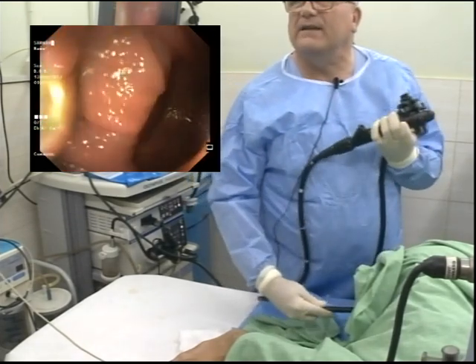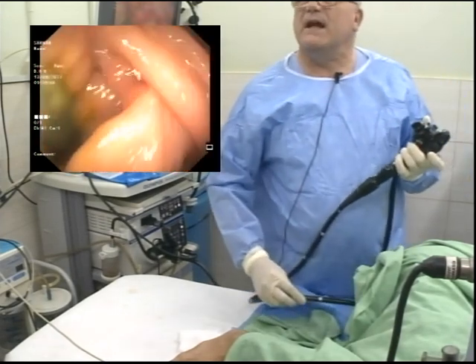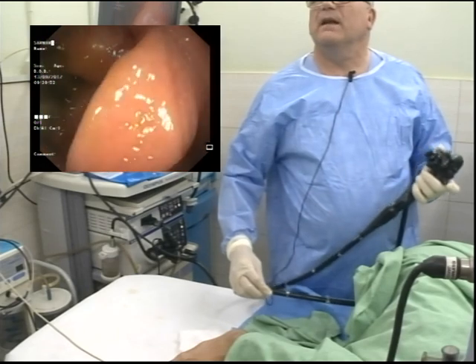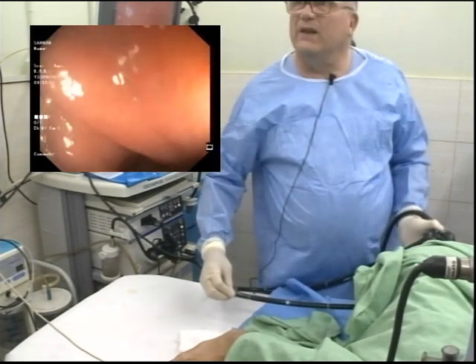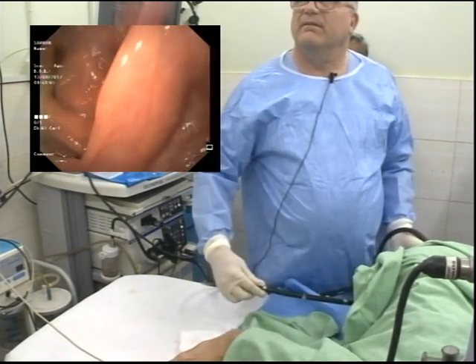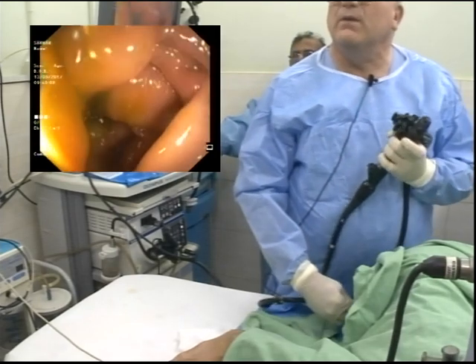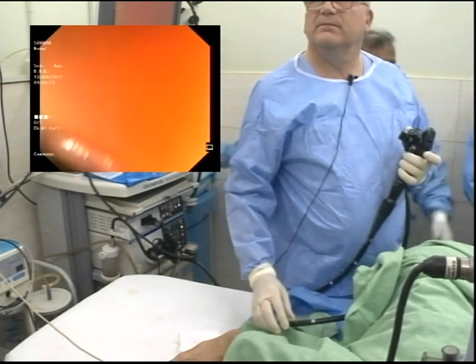Everybody starts to go, wow, 55 centimetres. But that means nothing, because now you've got to get into the cecal pole. And you end up putting a little bit more in. And now draw back. Sometimes when it doesn't drop in, and if you look, you can see now, no longer 55, we're back to 60. Keep drawing back, and now keep the torque on. If this doesn't go this time, the best thing to do for this patient is to put him on his back. Did you understand that? Yes.